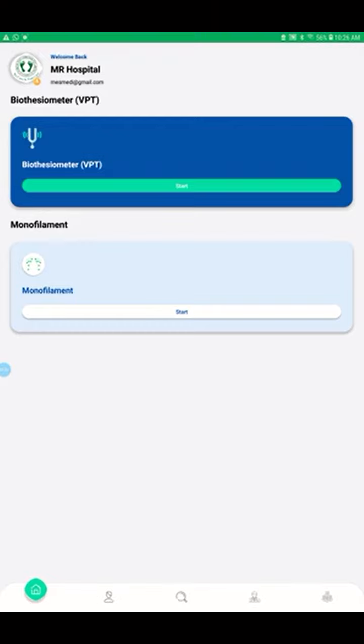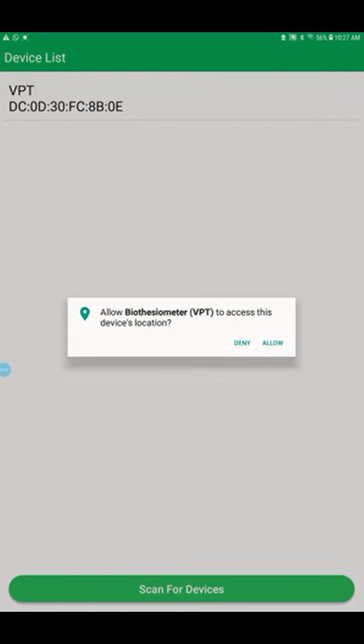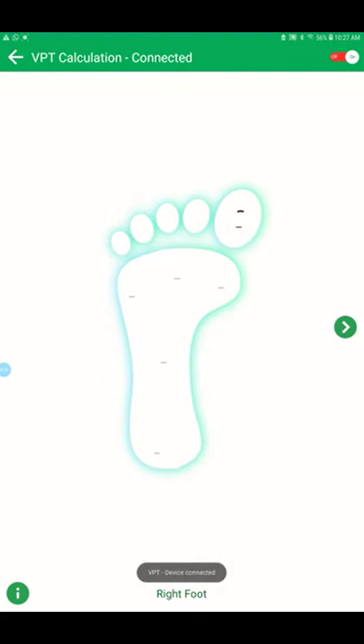So I select Biothesiometer. Okay, like any mobile application, it is asking us for access, so you have to allow it. You can see on the top VPT some number is there, you have to select that number. Then now it is getting connected. You can see at the bottom VPT device connected, and then on the toe it is circling.